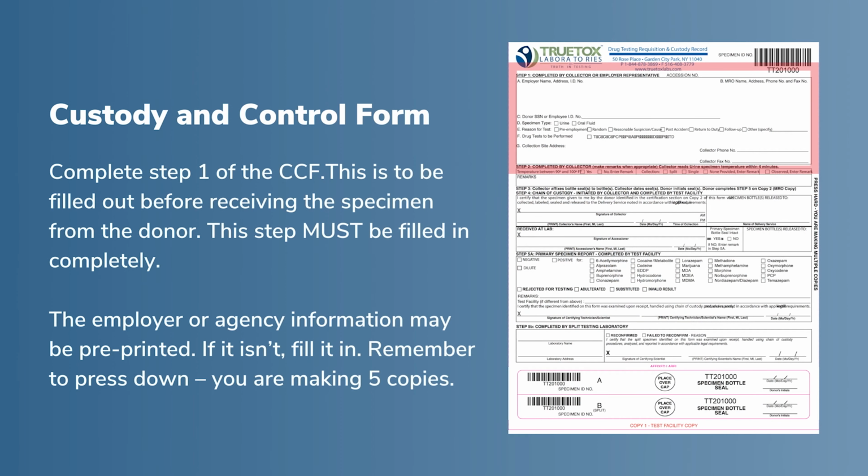Complete Step 1 of the CCF. This is to be filled out before receiving the specimen from the donor. This step must be filled in completely. The employer or agency information may be pre-printed. If it isn't, fill it in.